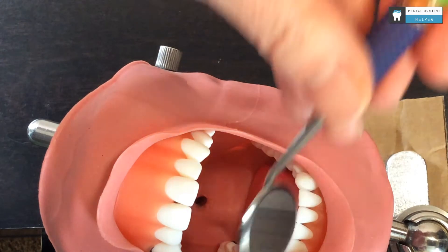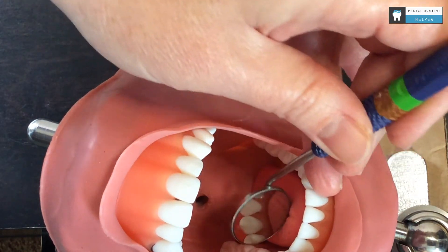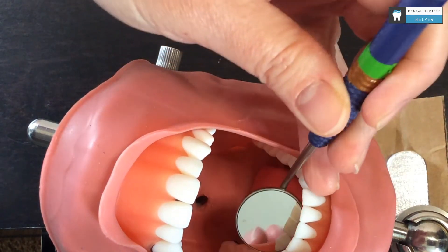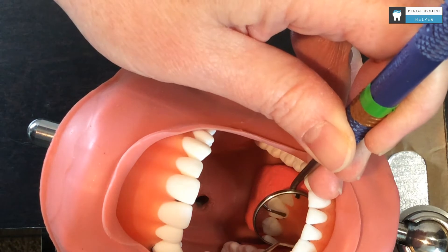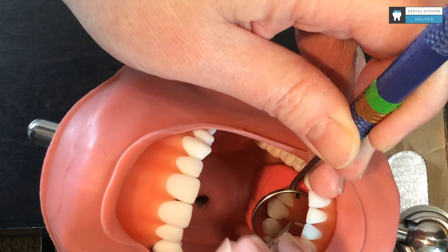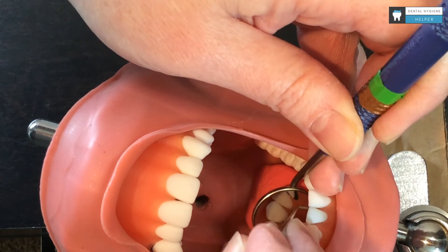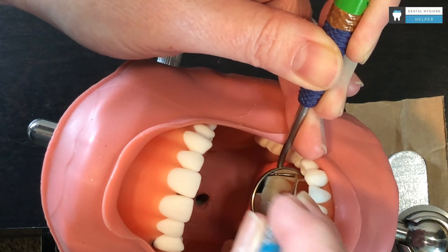And then I can put my mirror in the patient's mouth. I can rest either extra-orally or I can have an intraoral fulcrum here. I am using my mirror to push back a little bit against their tongue as I do all the surfaces away from me, again with my fulcrum up on the incisal edge, as I move across.